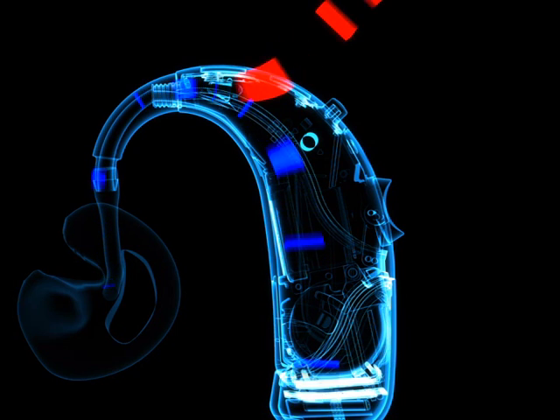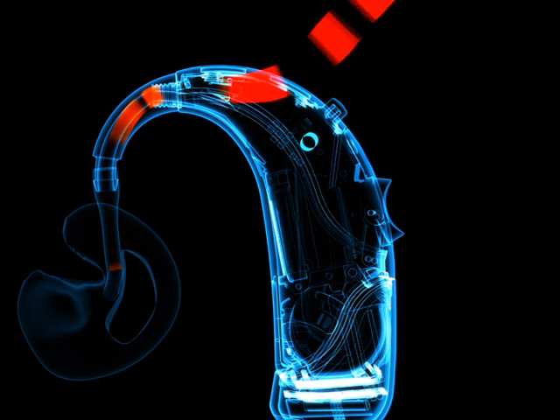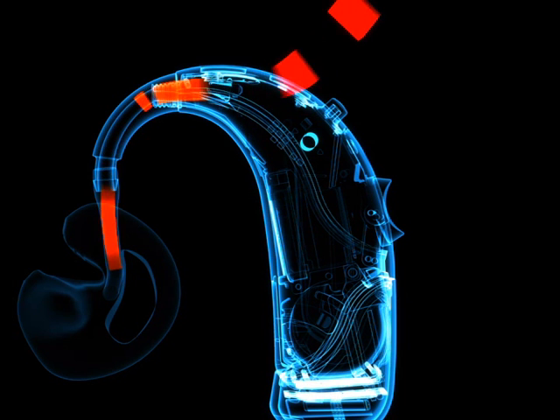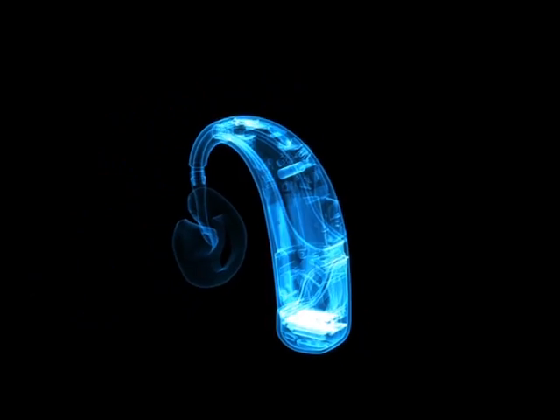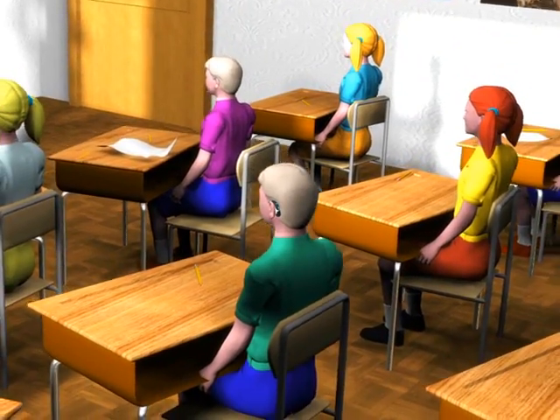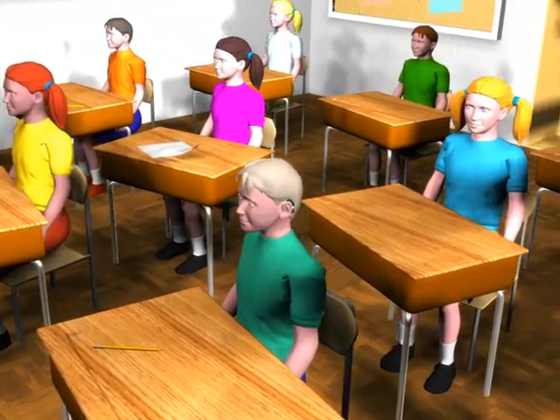When the teacher is not talking, the compression in the hearing instrument will allow for higher gain. The child's own voice and the voices of the children close by are picked up by the hearing instrument's microphone and can be heard immediately. The dynamic speech extractor runs fully automatically. No user action is required. When the noise levels drop again, the extra gain in the dynamic FM receivers is reduced as well, following the noise level fully automatically.